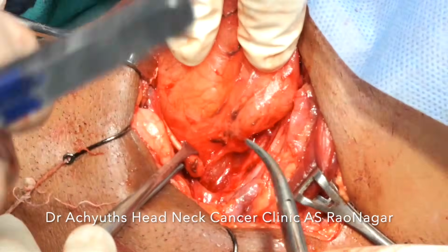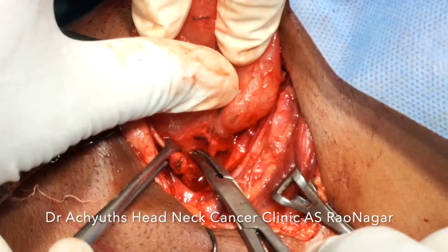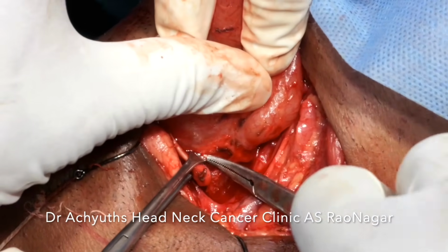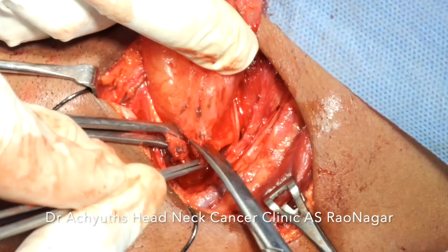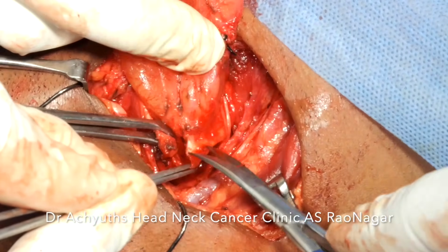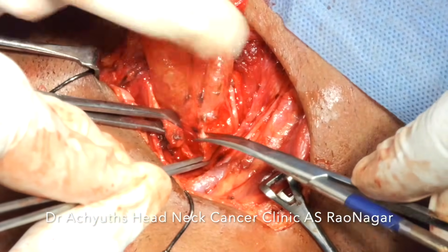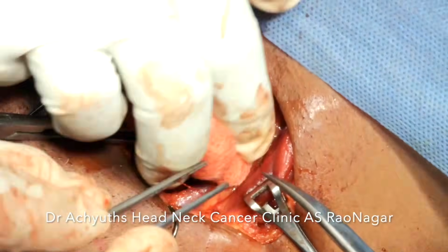With all these forceps we are giving traction and counter traction. We all know that head and neck surgery is all about giving traction, counter traction and sutures, that's all, and having anatomy and anatomical orientation of the structures which are being divided.